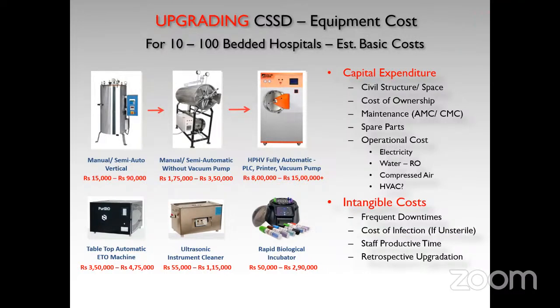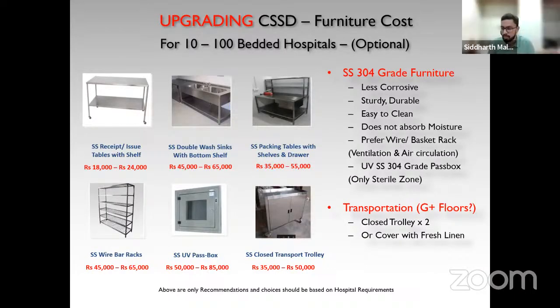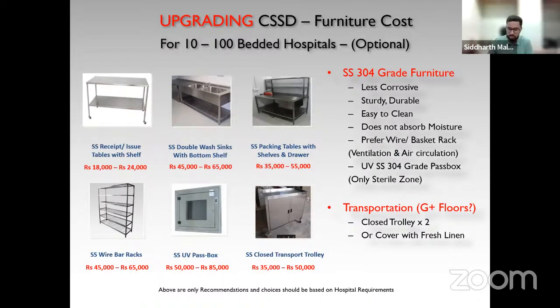One question, sir, Siddharth. Yes, sir. What is the protocol for sterilization of the operation theater? Which chemical do we use, and what is the disinfection of your OT, right, sir? Yeah, disinfection. So there is a separate module that we have for this. But just to give you an insight, do you have an HVAC system already in place, a HEPA filter?